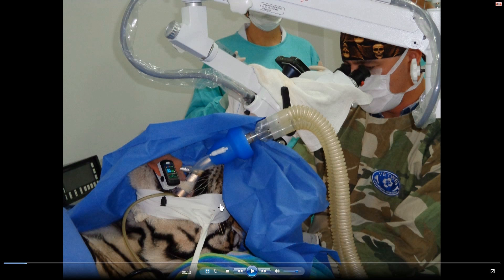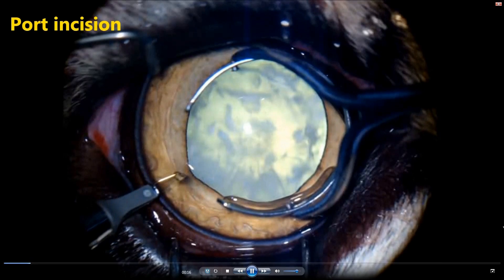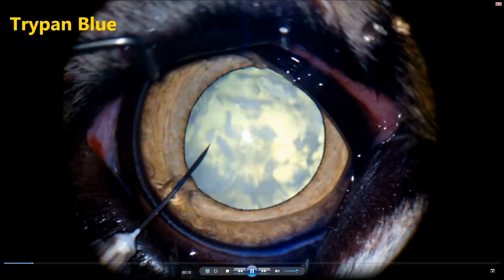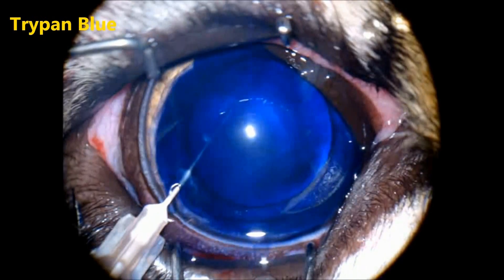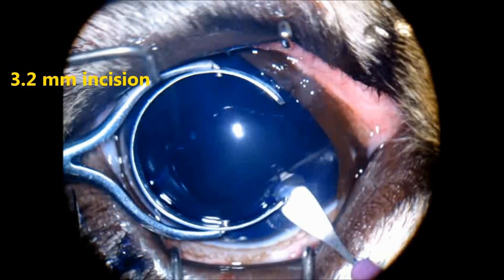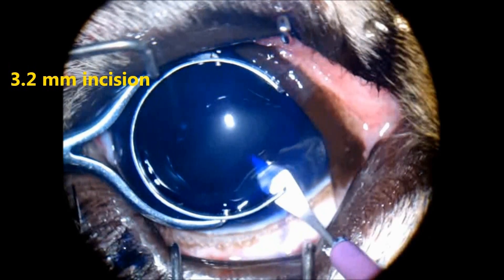Patient weight was 300 kilograms. This is the port incision with a diamond blade of 1 mm, trypan blue, and this is the main incision — a 3.2 mm incision.